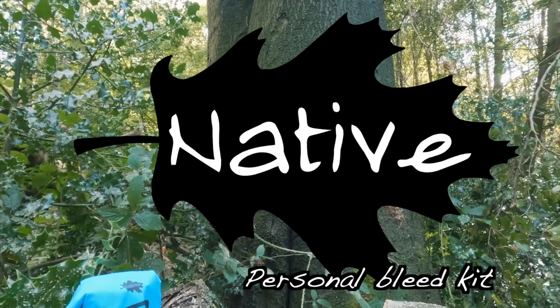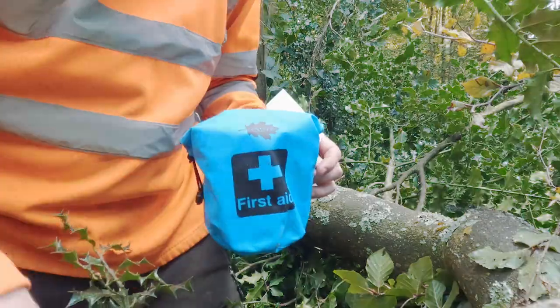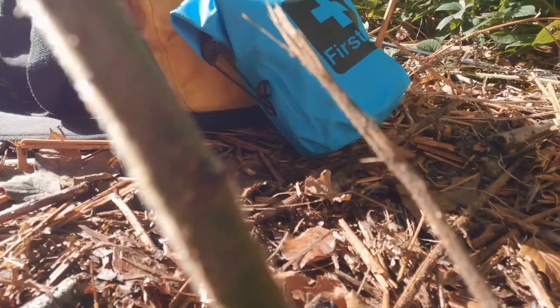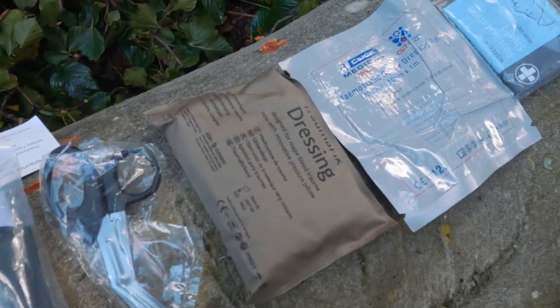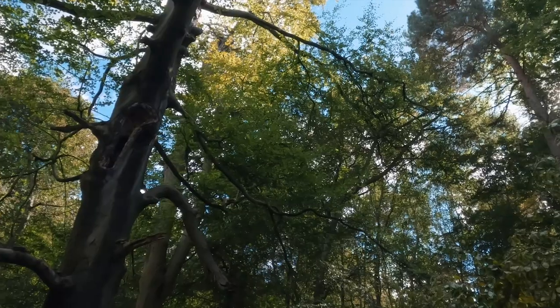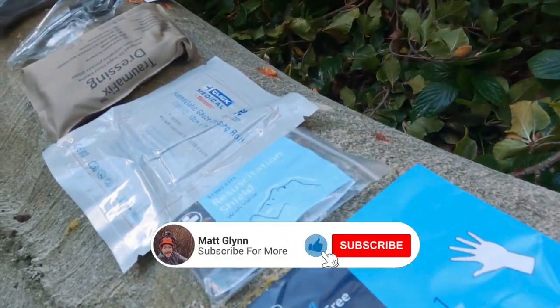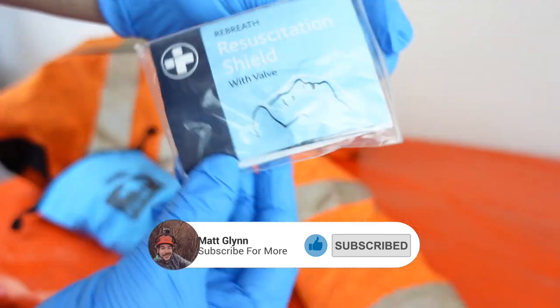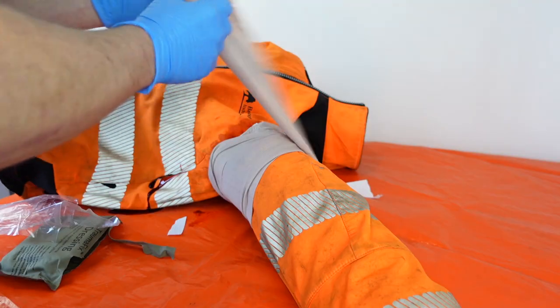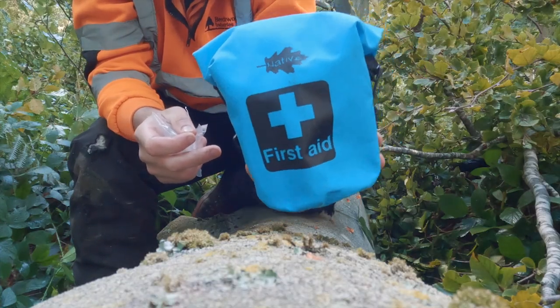Hello everyone, welcome to a first look at the Native personal bleed kit. This kit is the smallest in the Native range, designed for single person use. In this video I'm going to show you what's included, the features, and how some of it can be used. The personal bleed kit is HSE compliant and designed specifically as an individual first aid pack for arborists and forest workers, aiming to provide treatment for a wide range of trauma injuries in a compact kit while out in the field.